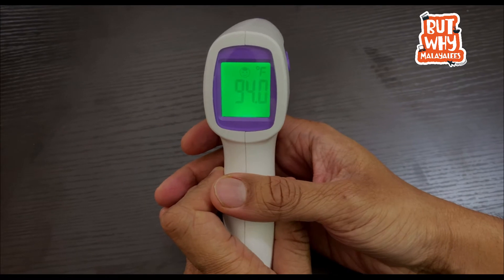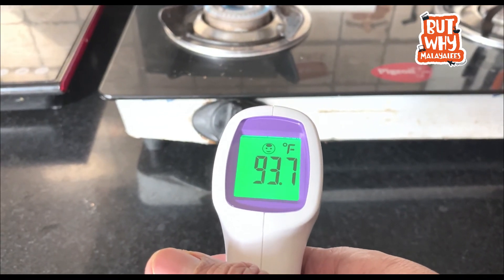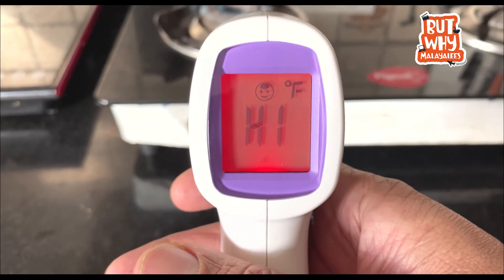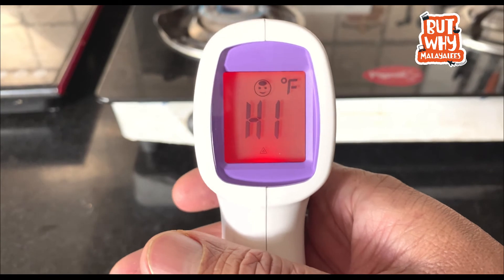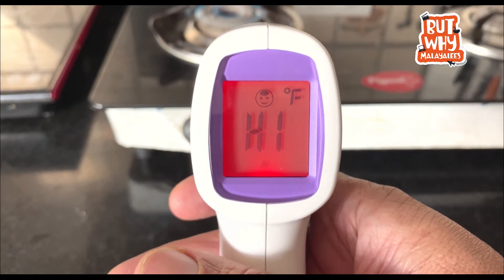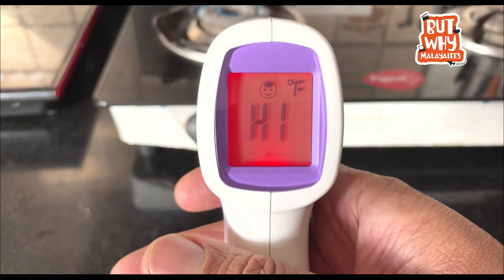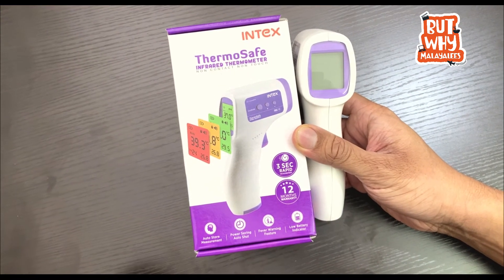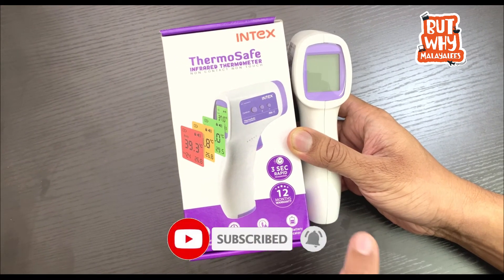Now, I am pointing at the temperature reading. I am pointing at 93.7 Fahrenheit. As I am pointing at a high temperature area, the In-Tex ThermoSafe Infrared Thermometer gives a 3-second rapid temperature scanning. We will scan the temperature within 3 seconds.